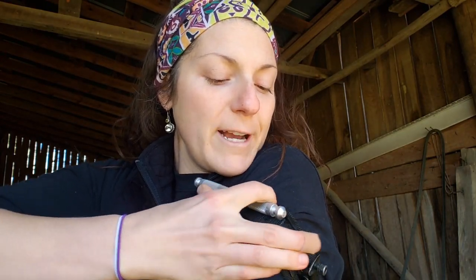When you crank down on the wound, you will know that your tourniquet is successfully applied: A, when the bleeding stops, and B, when you don't have a pulse downstream. So it will be uncomfortable, but at least the bleeding will stop. And when it comes to applying tourniquets, we do not take them off.